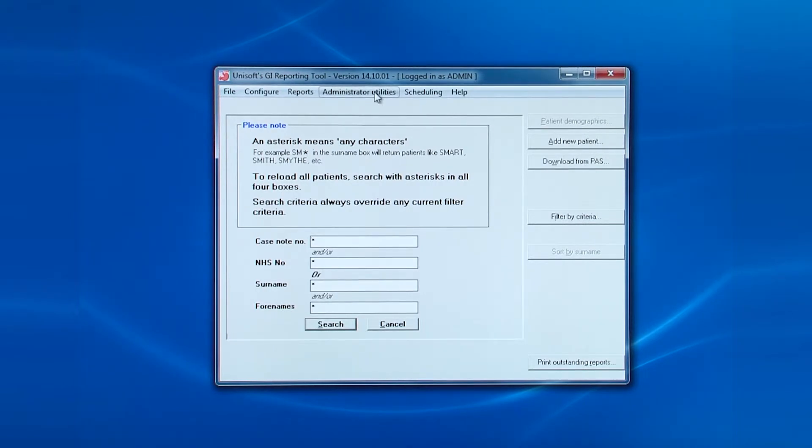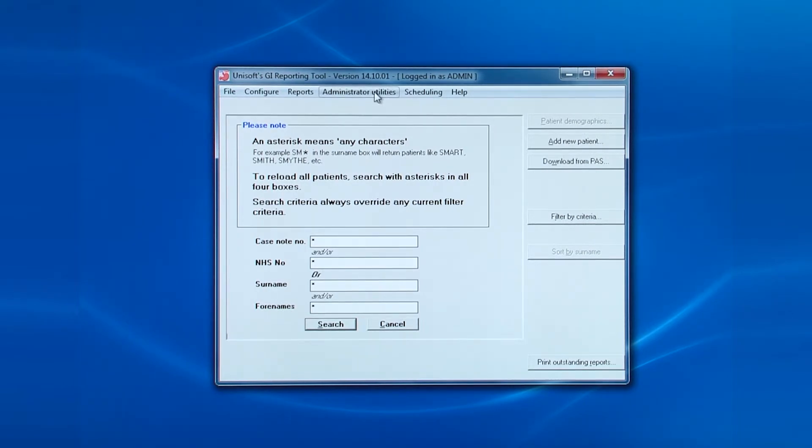The next entry allows you to manage the list of referring consultants. Referring consultants are basically the primary physicians who, at least in name, communicate hospital results back to primary care. When patients are referred to endoscopy from a GP practice, then the referring consultants will be one of the gastroenterologists in the department. So they will all need adding to this list.